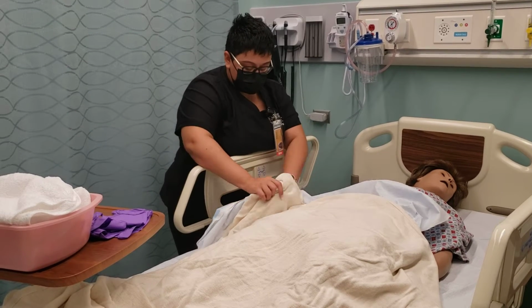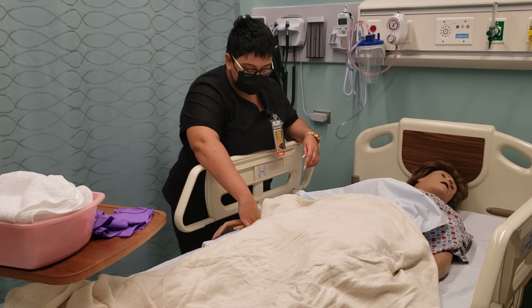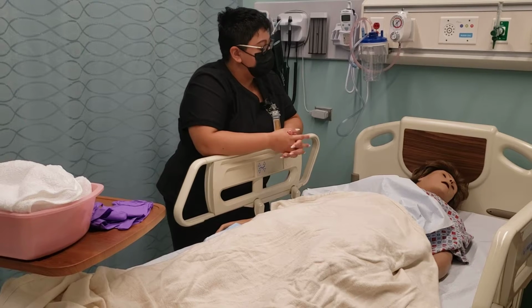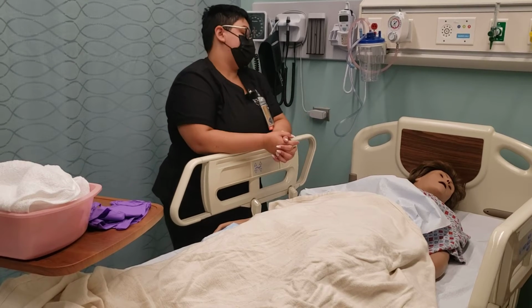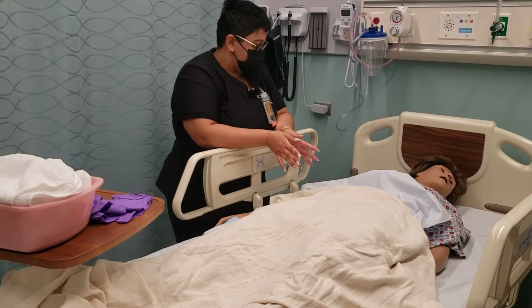Can I just check your ID band? Can you state your full name, age, and date of birth for me? Perfect. And I've already taken a look at your allergy record, but do you have any allergies to iodine or latex? Iodine? Okay, I will make sure we do not use that today, okay? Are you in any pain whatsoever? And are you comfortable in this position?